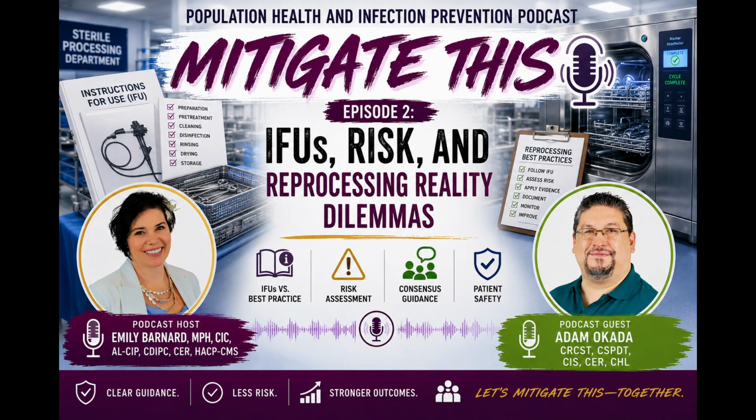By the way, always be careful with those customized instruments. Make sure that there are instructions for them. Because again, if there's not, the hospital is taking all of the liability with the usage of it. So yeah, don't accept instruments made in someone's garage. Definitely does not sound like a good idea, especially when you're including liability and patient harm.